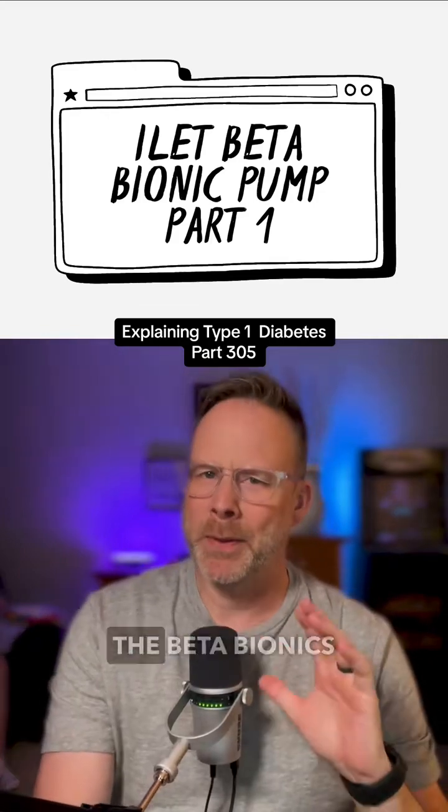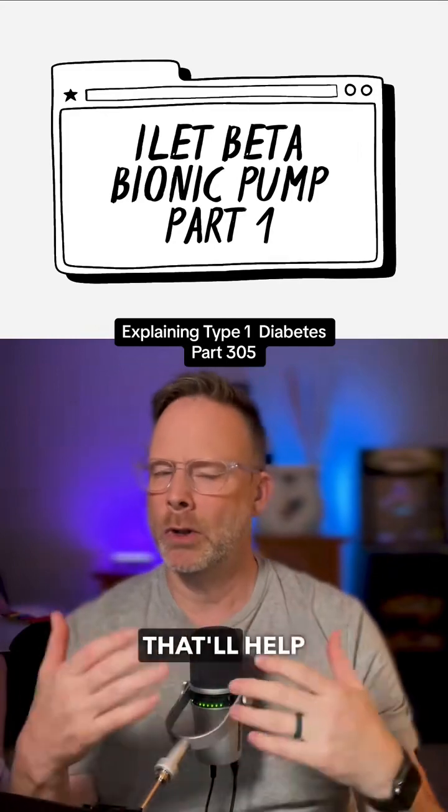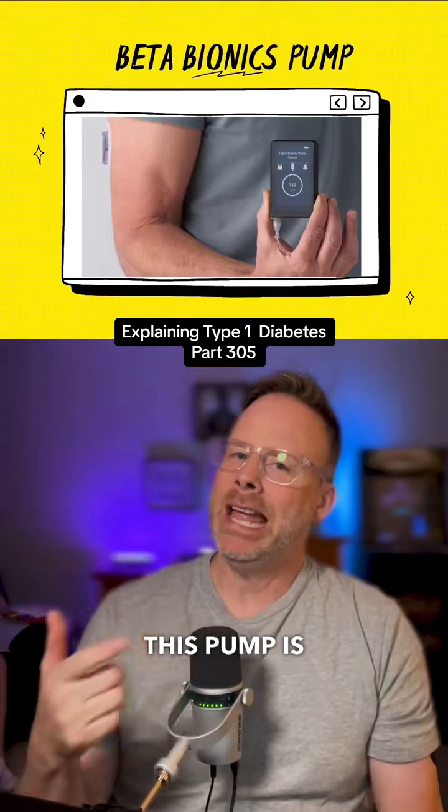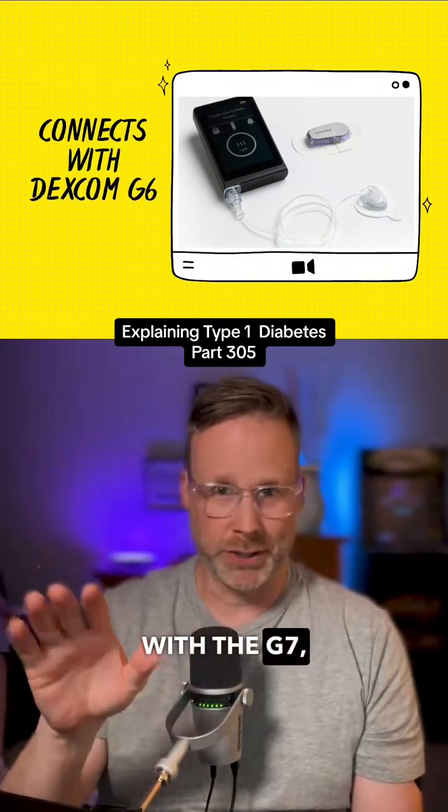You've probably seen people posting about the Beta Bionics iLet pump. Here are a few details that'll help us understand some more. This pump is FDA approved and it connects with your Dexcom G6 — it doesn't connect to the G7, and nothing does.